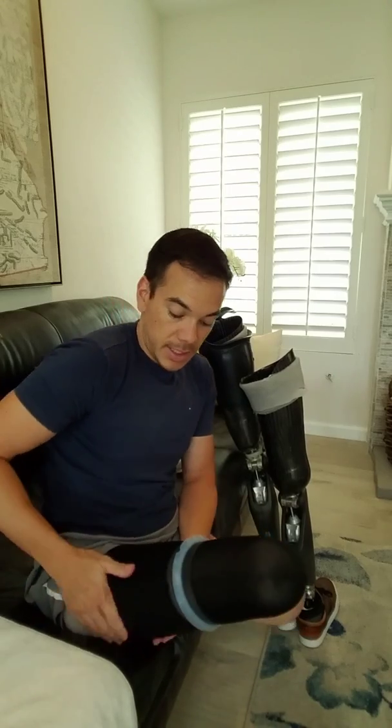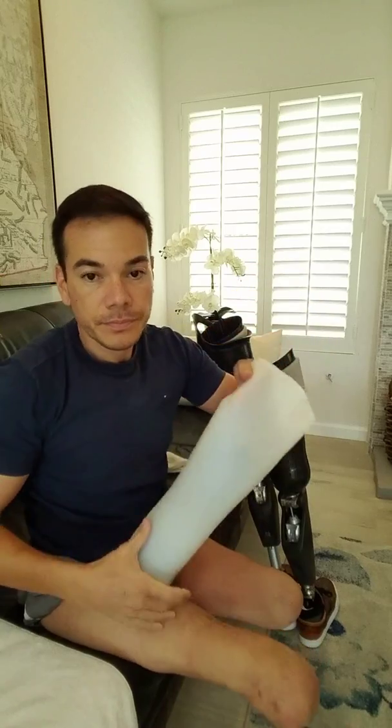This is the EcoSeal liner, which I just switched to a few months ago — I believe it's a silicone material. I leave this on here to make it easy to roll off as well. This is my knee disartic, or KD, liner, and this liner is silicone. Both liners are silicone, but this one is custom-made at my prosthetic clinic in Irvine — Southern California Prosthetics. They have a shop connected to their clinic which makes these liners — it's really cool.